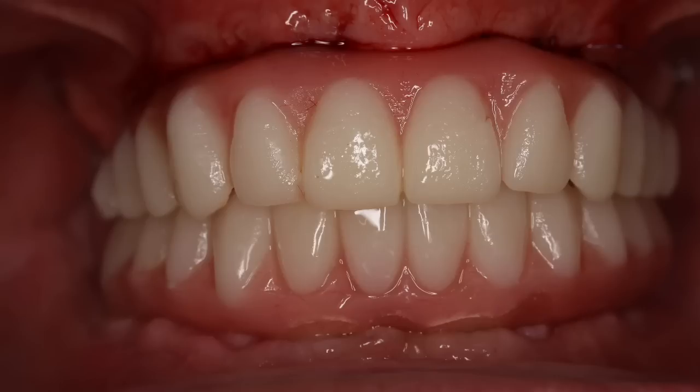And here you can see this is without any occlusal adjustments, because the pickup was done in a way where the bite was already established. So now we have a provisional restoration, or a set of provisional restorations, that resemble what I expect back from the laboratory.